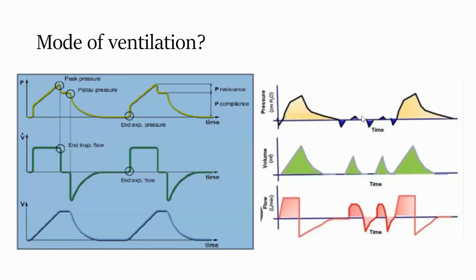Because whenever the patient breathes, it will allow the patient to breathe, but when the time comes to deliver a breath, the machine tries to synchronize. So there is a synchronization window, a so-called 0.5 to 1 second synchronization window. For example, if you set the rate at 12, the breath will be delivered every 5 seconds. So at 0 seconds, deliver a breath, and at 5 seconds, there is a mandatory breath that's going to be delivered. So if the patient triggers at that point, it will blend in with the motion. That's why the term synchronous is used.